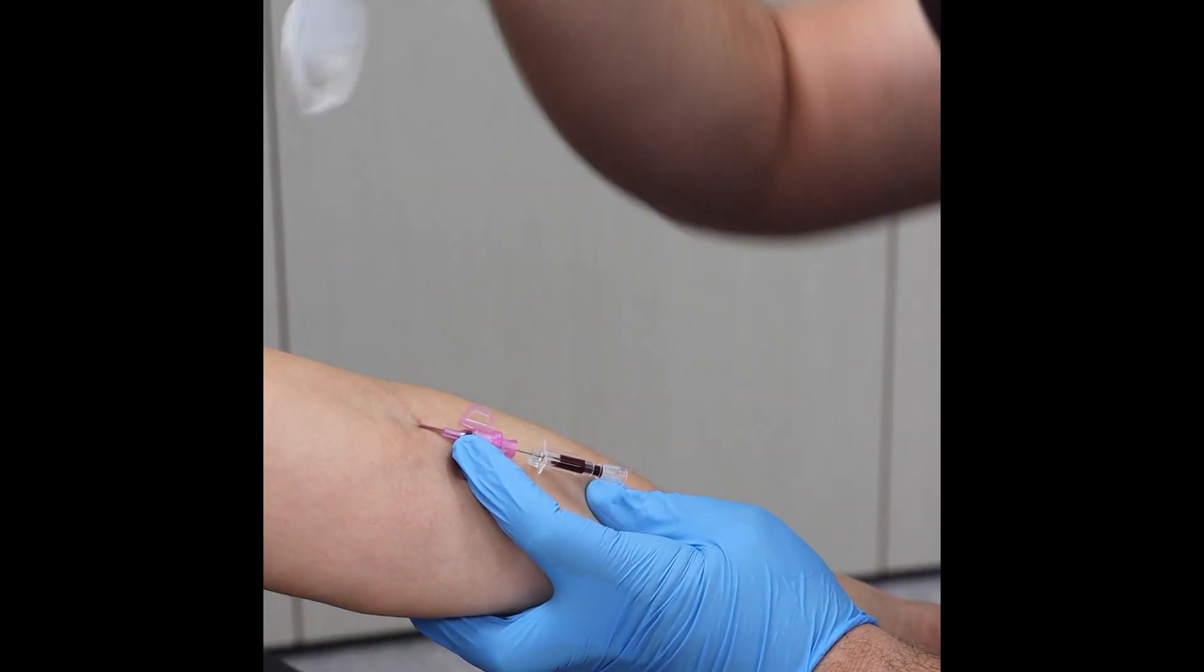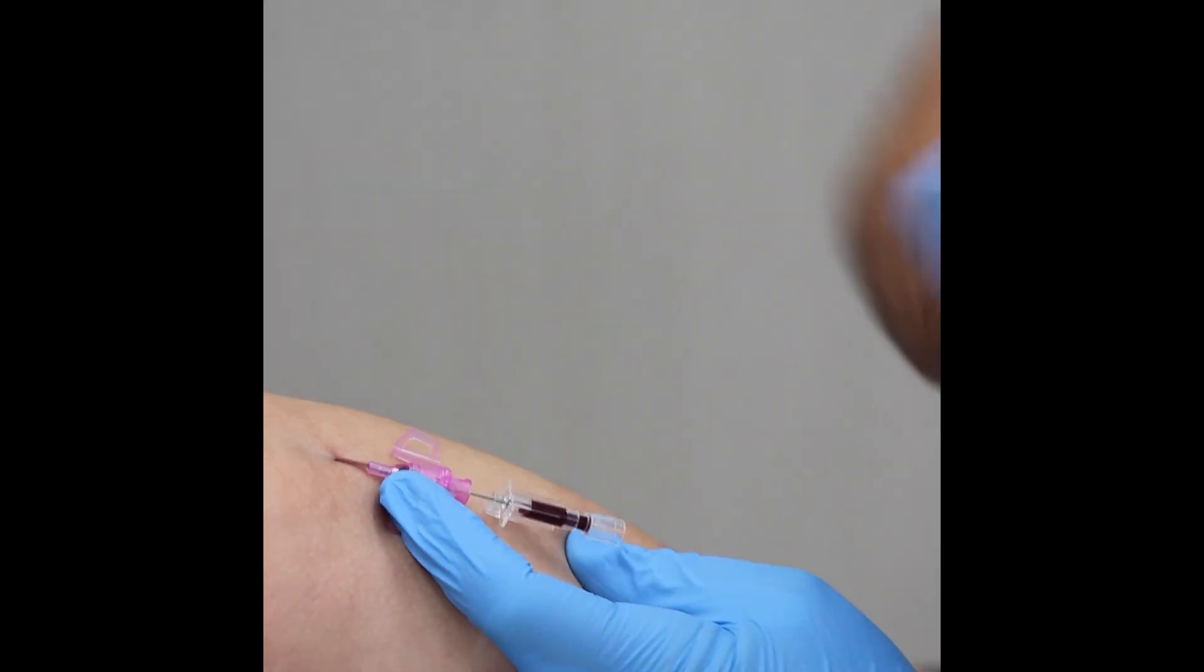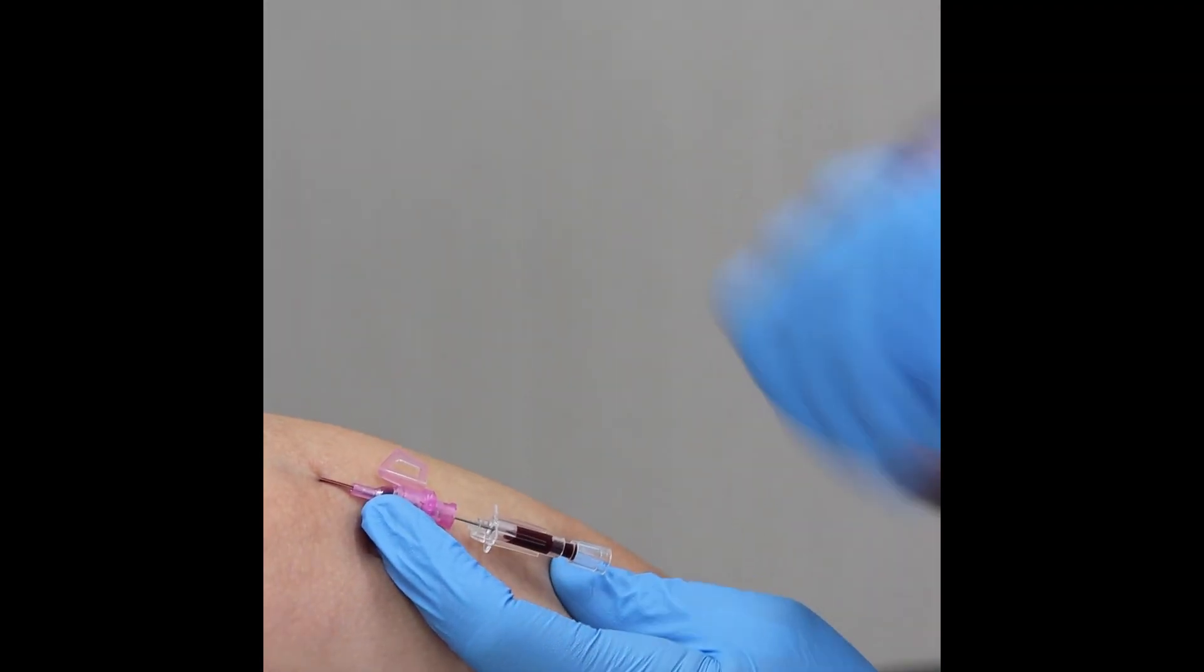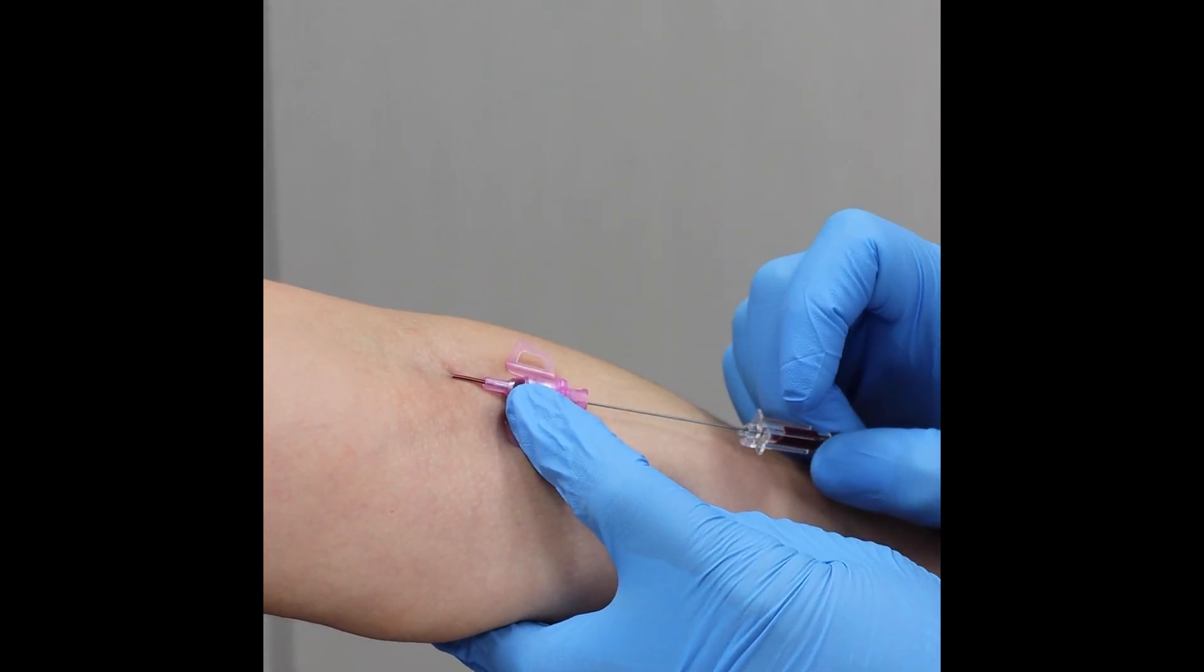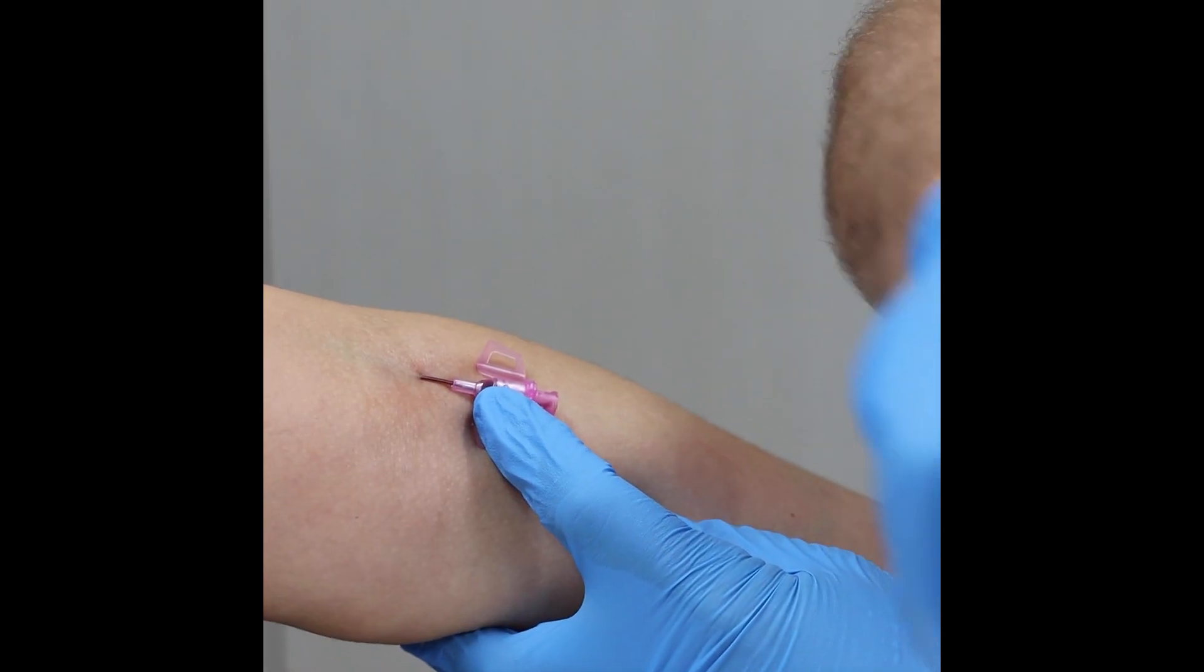I'm going to take the tourniquet off. I don't want any blood to pour out. I've got my sharps container ready and I'm going to take the needle out. But it's still not all the way in. I've taken that out, sharps away.